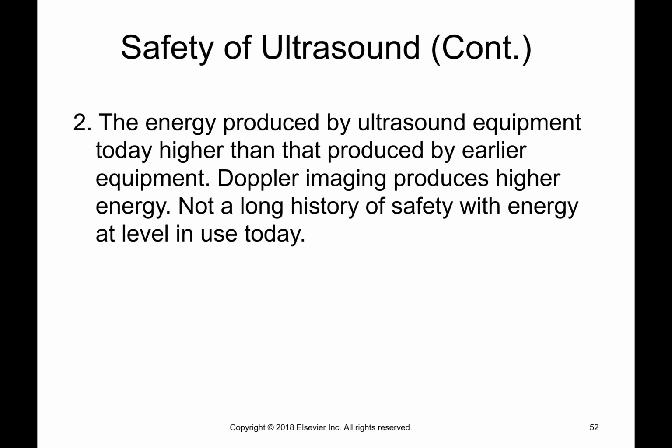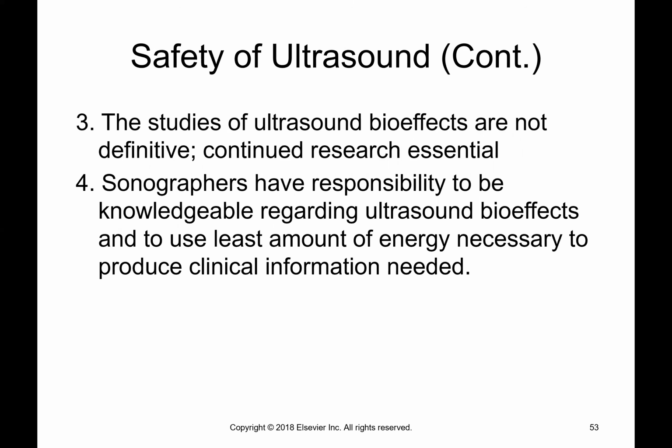The energy produced by ultrasound equipment today is higher than that produced by earlier equipment, and Doppler imaging, like pulse wave Doppler, has higher energy. So there's stuff that you just don't want to continue to do if you don't have to. The studies of ultrasound bioeffects are not definitive, and continued research is essential.